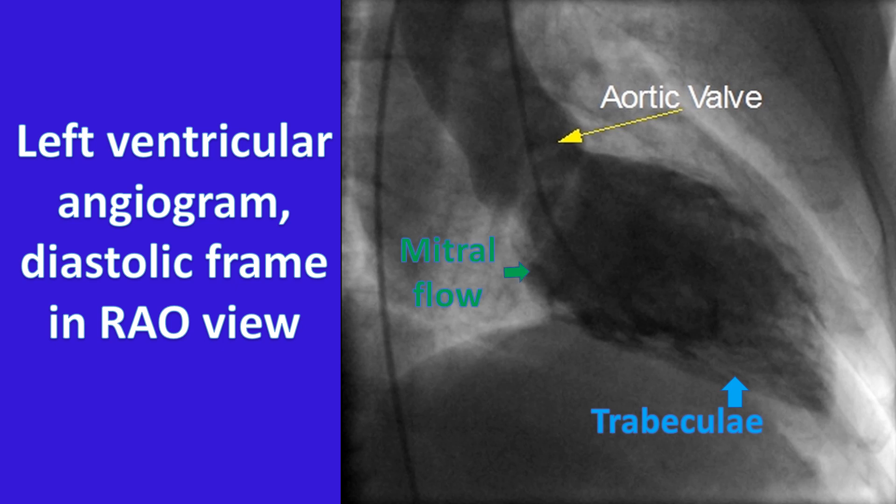A negative shadow of mitral diastolic flow can be seen at the posterobasal region. The thickness of the left ventricular wall can be assessed by noting the distance between the contrast-filled cavity and the cardiac silhouette, especially in the anterolateral region.